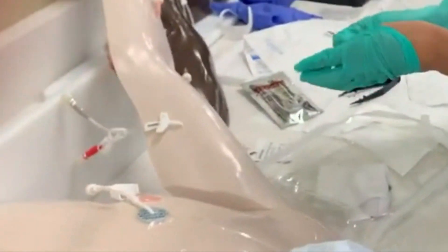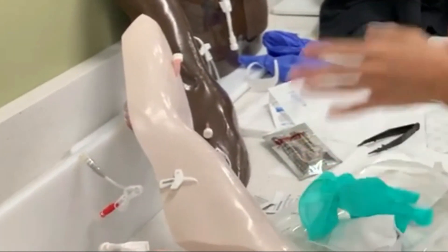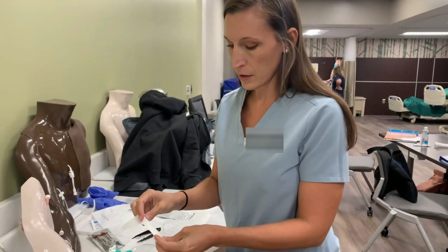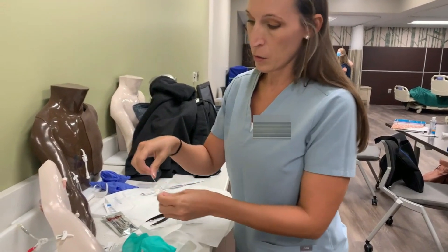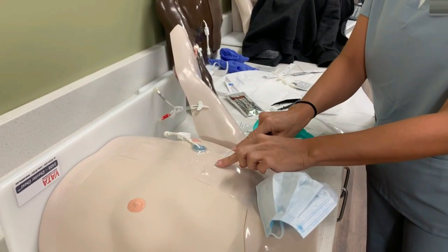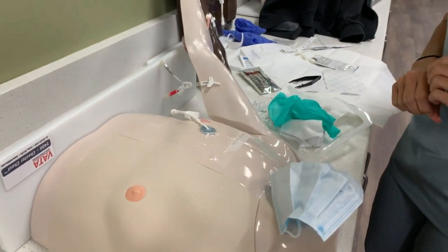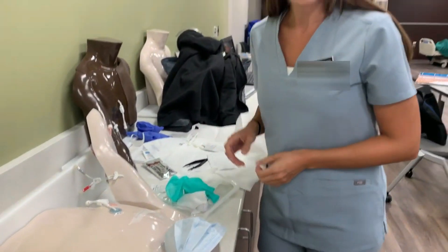Now discard these gloves, then wash your hands. I have a pen — you'll write your initials, the date, and the time you changed the dressing. When you put the label tab on the dressing, put it where it does not cover what the dressing is for — you don't want to cover up an IV site. Then throw all of your supplies in the garbage, and that's it.